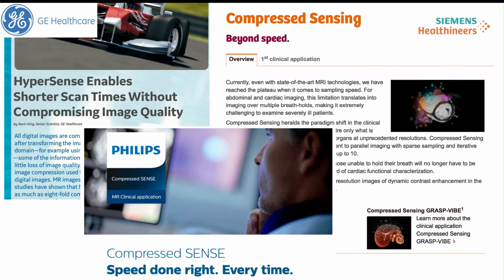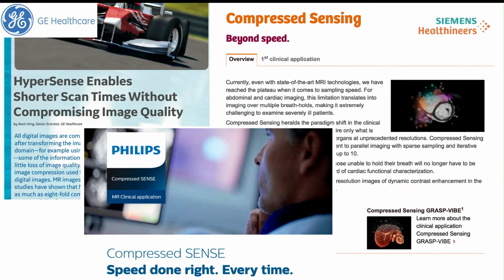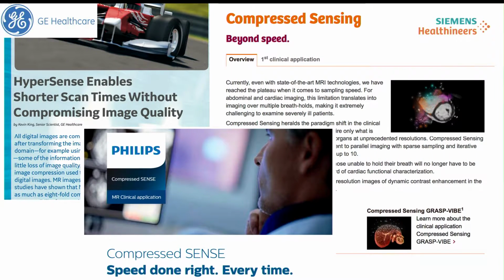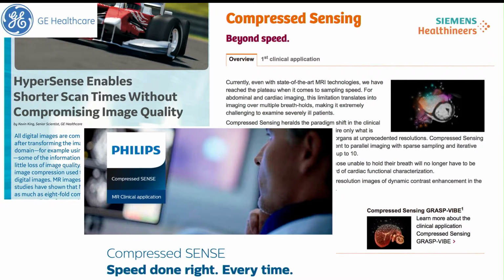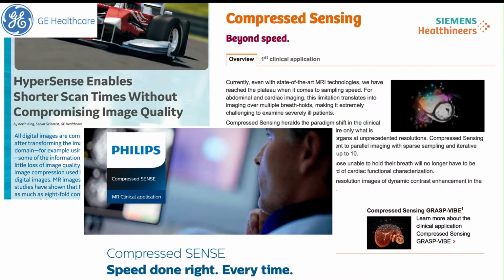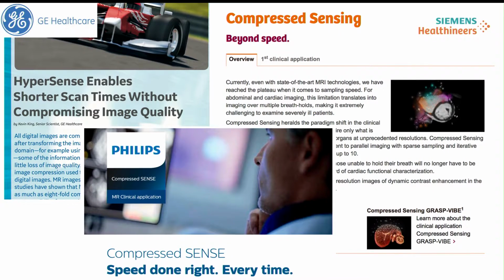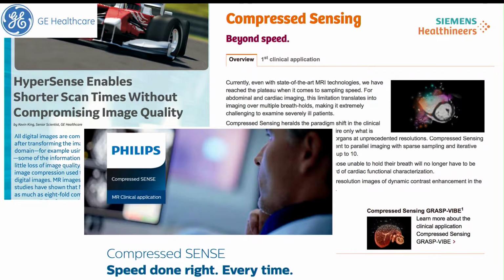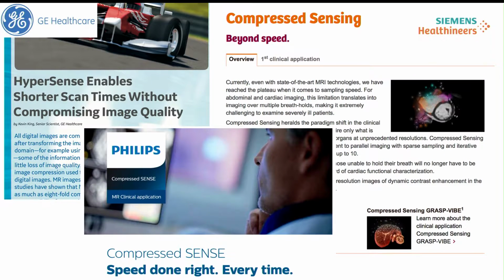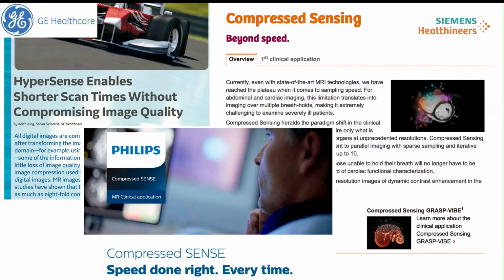And this idea, which is called compressed sensing, is actually used in the clinic. Every major MRI vendor has implemented this idea. You can go get an MRI scan today and potentially be using this kind of technology that speeds up the acquisition by factors of up to 2 to 3 relative to what was done before. So it's actually having a significant effect. And the turnaround time for this was about 10 years, just for frame of reference.